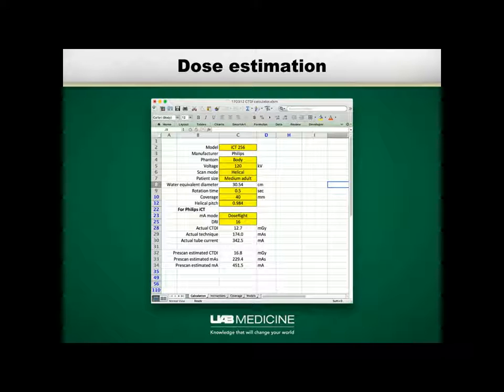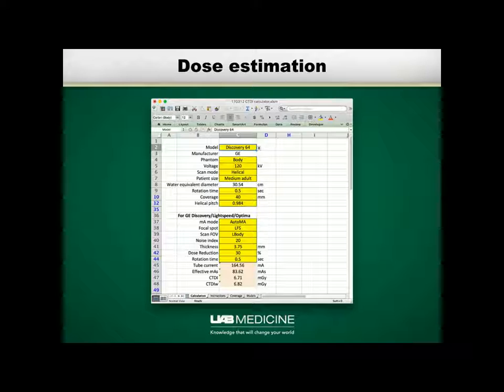When you've got AEC, it becomes a little bit more complicated. Now you've got things like, in this case, the dose right index. Instead of determining the mA, you have the dose right index that will set the mA for you based on the patient size. Well, you better tell which patient size I am going to be making this estimate for. And then, again, with different scanners, the GE doesn't have that dose right index, but there's something called the noise index.